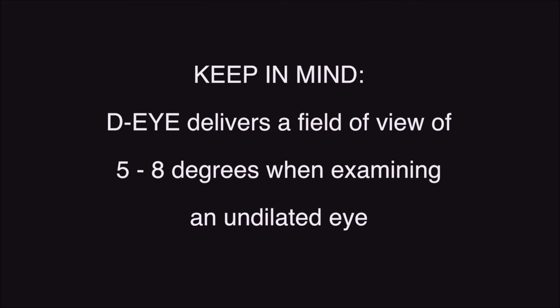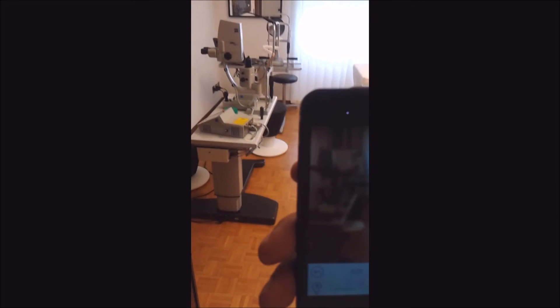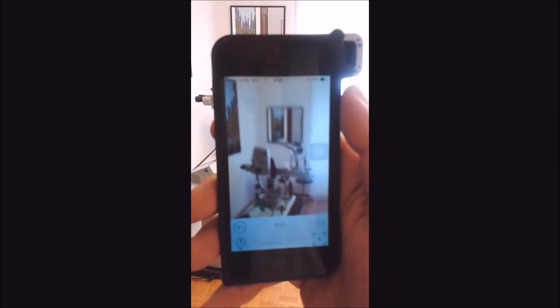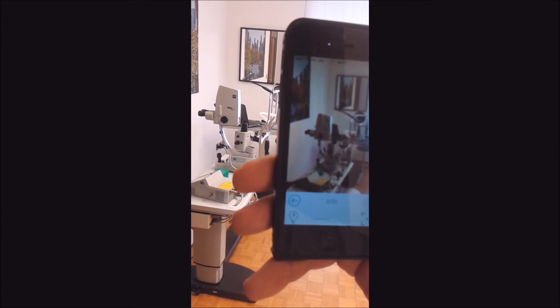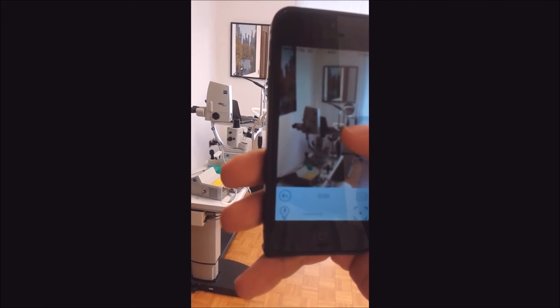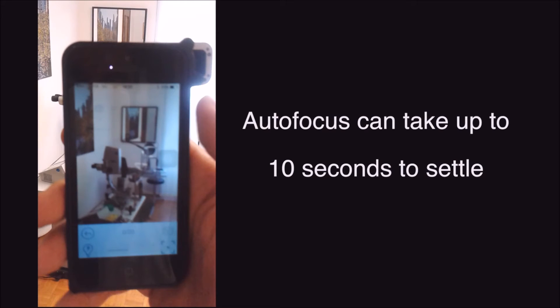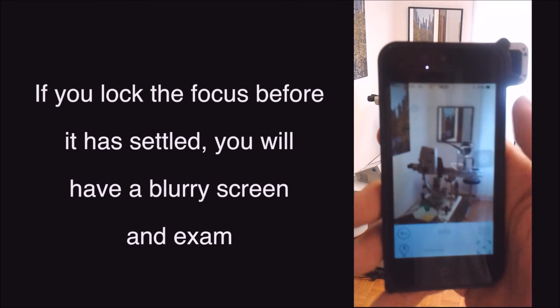DI delivers a field of view of 5 to 8 degrees when examining an undilated eye. It is best to start with a dimly lit room, but not too dark, so the camera focus can aim at a fixed object on the wall or the edge of a door frame so the autofocus can begin to settle. As you may have experienced taking regular pictures with your smartphone, the autofocus moves in or out until it finally settles and the image is crisp and in focus. Sometimes this autofocus function can take up to 10 seconds to settle, so do not be in a hurry, because if you lock the focus before it has settled, you will have a blurry screen to start and a blurry exam when finished.